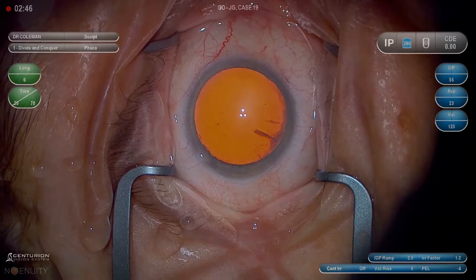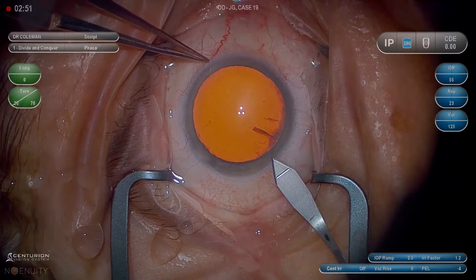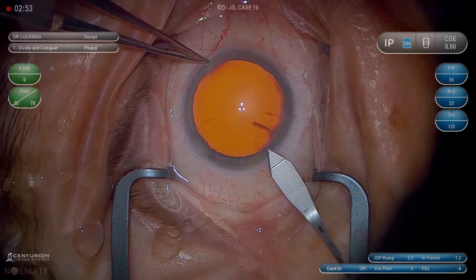The main wound starts 0.5 millimeters anterior to the limbus. We want to make sure that we don't push it down when we're making our main wound, because that can track back into conjunctiva.